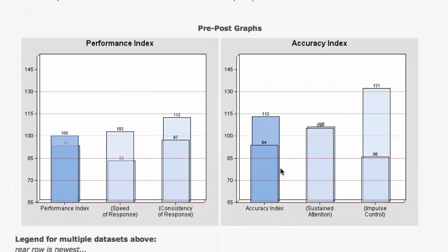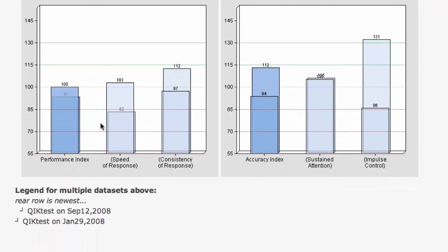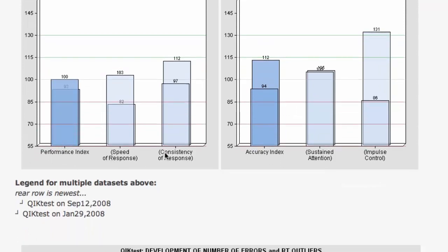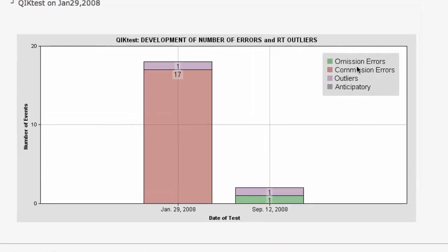This is the wonderful pre-post segment of the test. If you upload a second Quick Test for the same individual, you end up with a second bar graph. This is a sample for this video, so it's rather arbitrary — I apologize this isn't a pretty example. We put the newer test behind so that hopefully as scores go up, we'll see them be higher in the back as they extend into the distance. We see the performance index, speed of response, consistency of response, accuracy index, sustained attention, and impulse control all mapped out. Then we see score development, which breaks down the two test dates and breaks down omission errors, commission errors, outliers, and anticipatory responses across those two graphs.